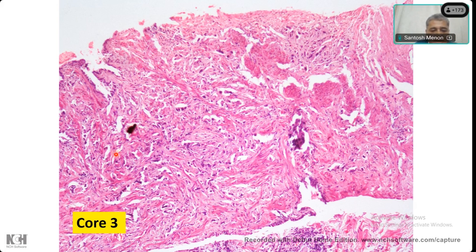Do you think there are any gland formations here? No, sir. I think first, is it cancer or not? It is cancer. So you see all these single cells look like cancer to you? Yes, possibly. My point is not to see; you have to obviously look at your own slide when you come across this. But when you see such a focus, please go to higher power and look at them more carefully.